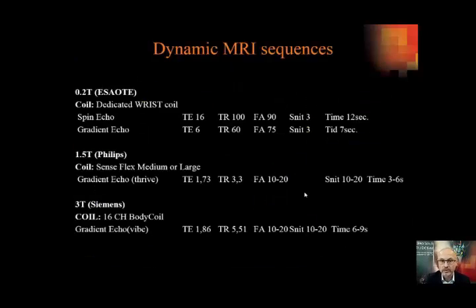We do dynamic MRI in our center using all different kinds of field strength, from 0.2 Tesla to 3 Tesla, and we have protocols developed for that, which we are happy to share if anyone would like that.